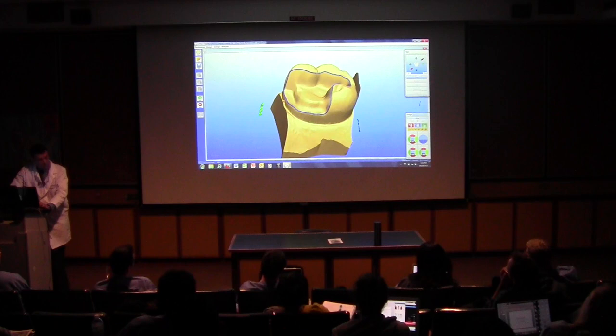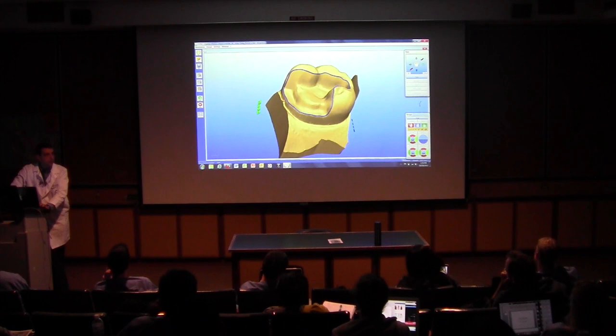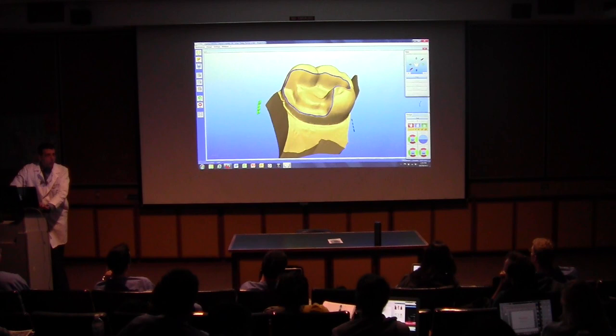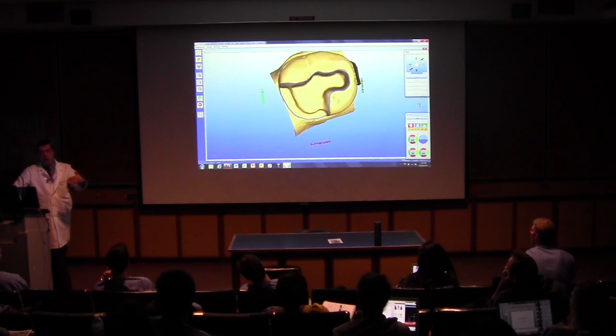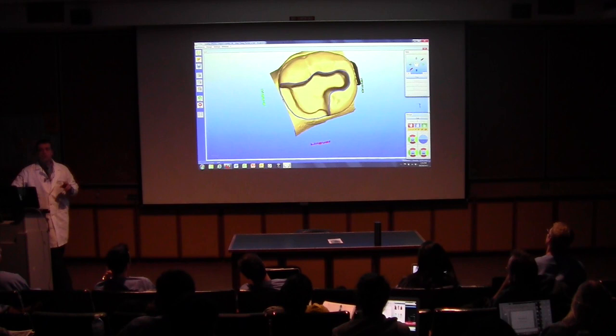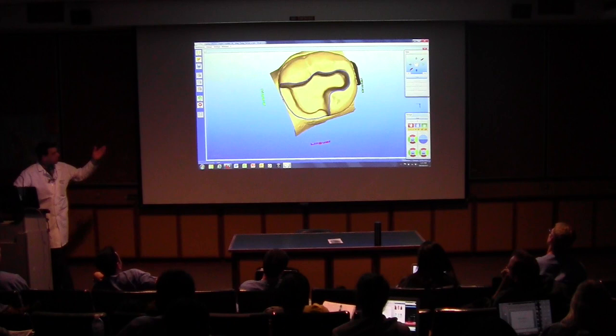Clinically speaking, this is the step where I like to go back to my patient's mouth and double check that my margins are in the correct position. Do you understand now why it's so important to have a decent 90 degree angle on the cavosurface margin? Otherwise the computer won't find the margin, and it's going to be even harder for you. You're not supposed to be guessing where the margin is. That's why Dr. Porto mentioned the finishing diamond points, that you have to recreate the 90 degrees.